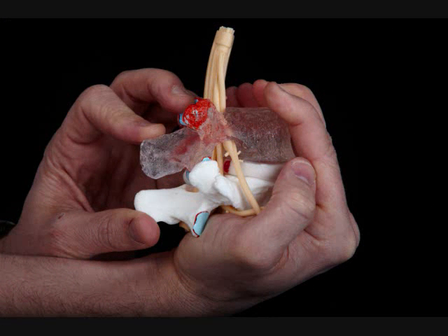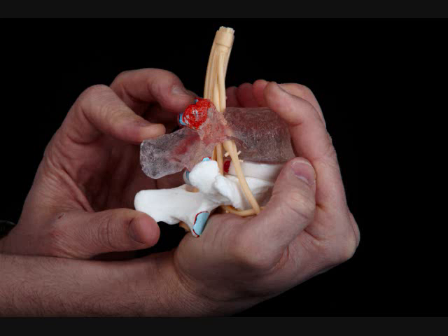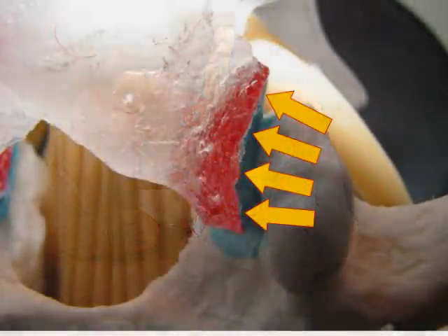As you can see, the model is best compressed when using both hands. You want to hold the spinous processes relatively closer together to one another and demonstrate realistic motion so the facets don't slide too far up with the model.